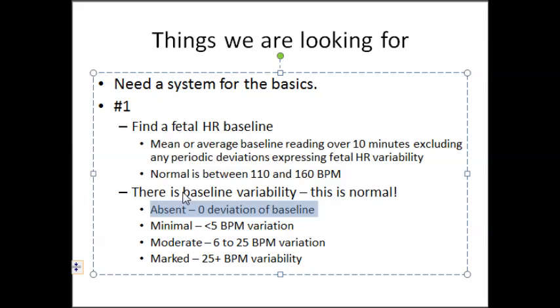If you do see variability, it is normal, but absent, this is not always the best. Normal heart rate is between 110 and 160. So a fetal heart rate of 110 shouldn't throw any red flags, but if you start dipping below 110, you'll get fetal bradycardia, and that maybe will be cause for concern, but we'll talk about that in a little bit.